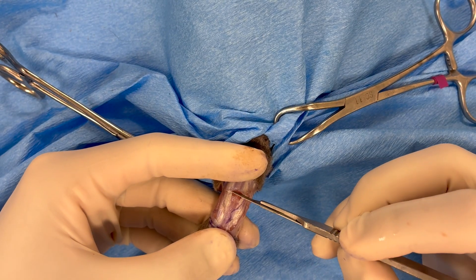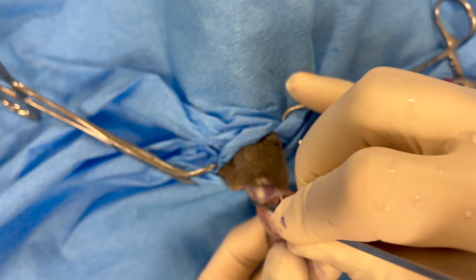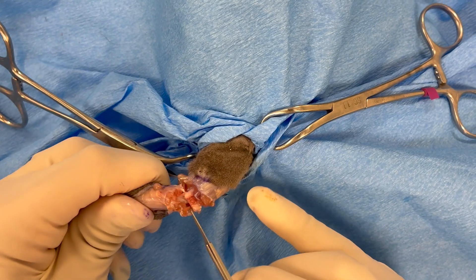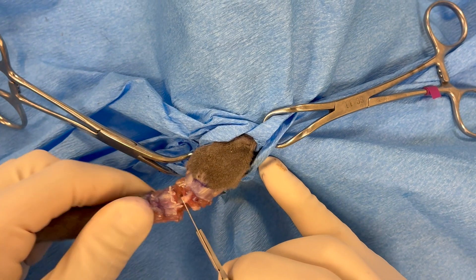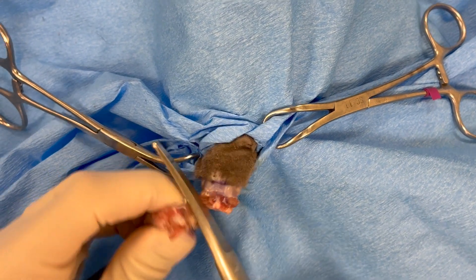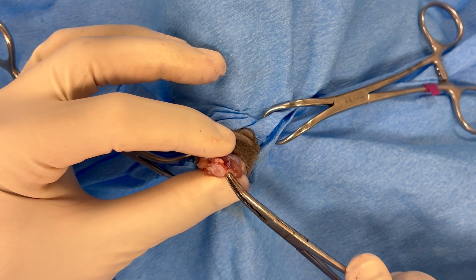The muscles are transected sharply with either a scalpel or electrocautery all the way down to the bone. Here a scalpel is used to perform the disarticulation between the caudal vertebra. It's also acceptable to take a bone cutter and transect across the bony structures of the tail.